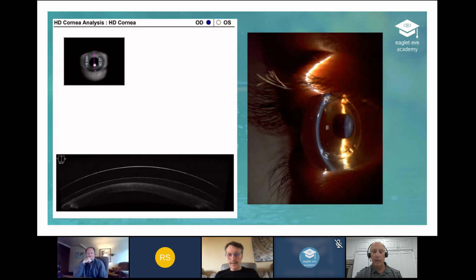Emmanuel asked the difference in elevation between steep 4 and steep 10. In this lens, there's a 30 microns difference per step. So in that case, you've got 6 steps, which would be 180 microns difference between those two. And you're hitting the limits of the lens, because steep 10 is the steepest possibility they have in that one. So then sometimes you need other lens designs that can go steeper or flatter, and that's the beauty is, as the doctor, we're going to choose which one we feel is right for this patient.